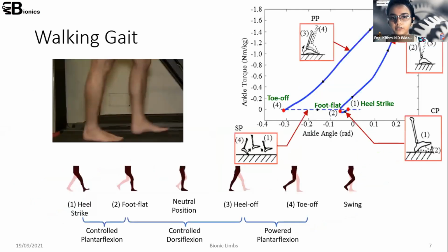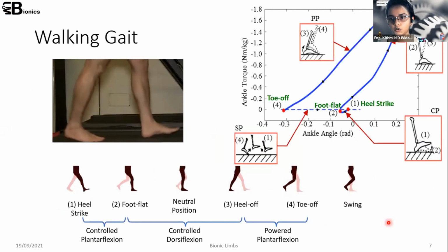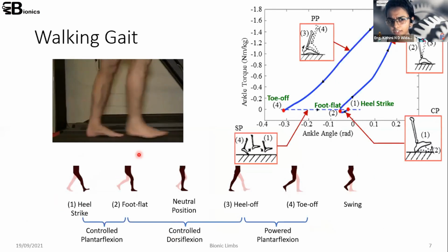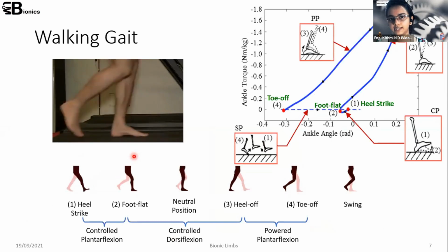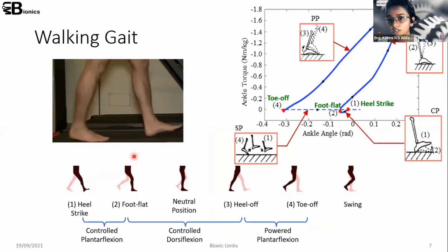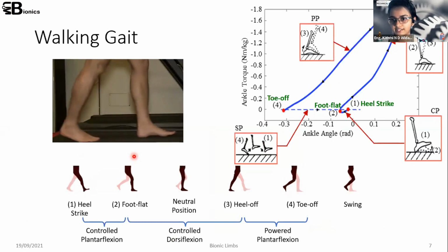And then as I told you before, we had to read a lot. So when reading about biomechanics and walking gait, we identified that, as Engineer Pupudu Pranavira said yesterday, maybe you can remember, we have 2 main phases in walking: stance phase and swing phase.